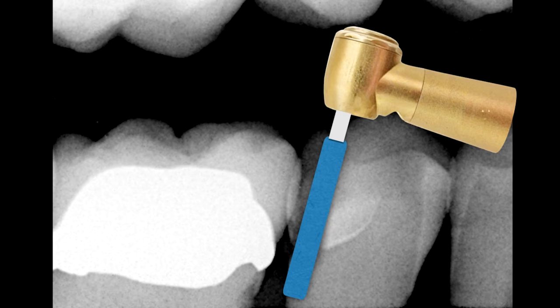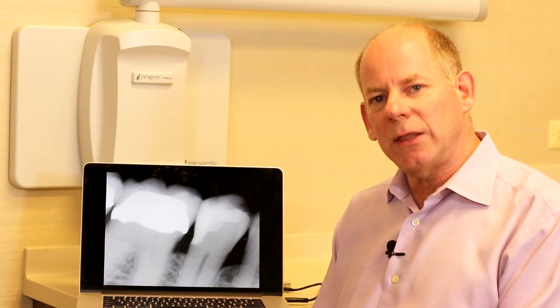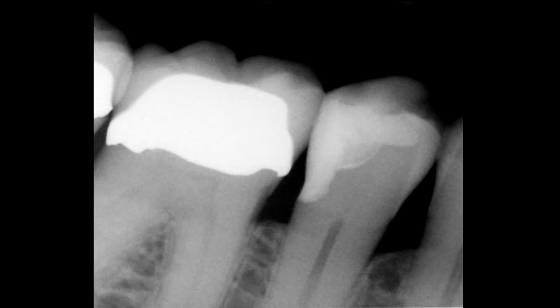I need to use a longer bur — a tapered diamond bur — so I can extend all the way down to that caries area. I may need to use caries removal burs or diamond burs, but at some point I have to make sure I've eliminated all the caries and have a nice sealed cervical margin. You can see the restoration follows the root contour before merging out to create that subgingival emergence profile, giving a nice contour following the proximal wall contour we'd normally see with a bicuspid.